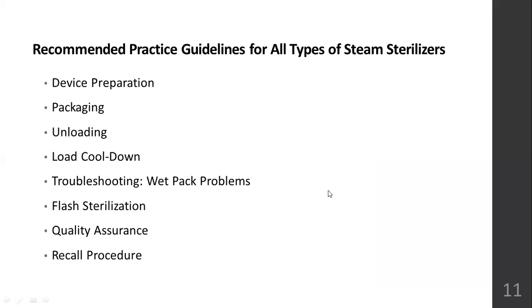Recommended practice guidelines for all types of steam sterilizers. Device preparation: before sterilization, you have to check whether the item is working, and whether breakdown maintenance and preventive maintenance were done, so it is functioning properly. Is there any overload? What is the capacity? All these things you have to check before putting things into the devices used for sterilization.